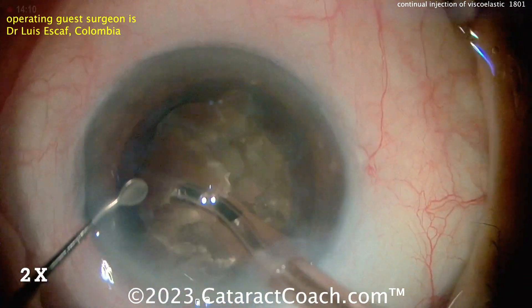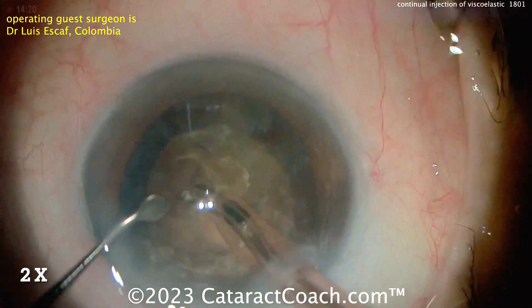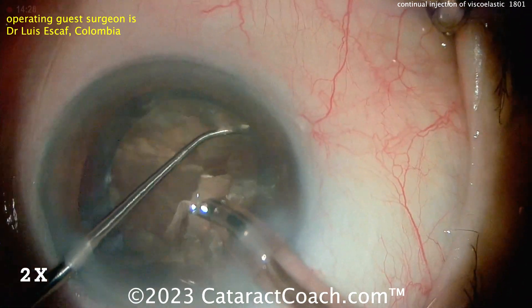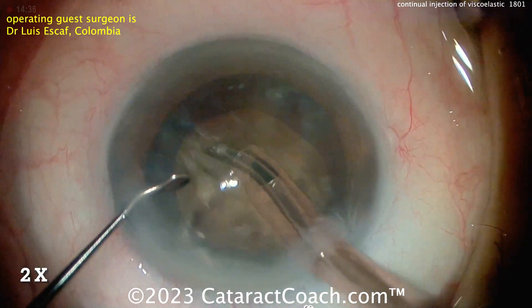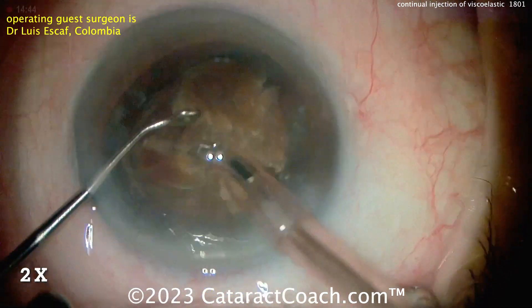Now, this brunescent cataract — you see it's still kind of attached. That's that fiber, thick, dense, leathery posterior plate of the nucleus. So sometimes it's hard to really split these pieces. It's why you've seen videos of tilting the nucleus out of the bag, getting the chopper on the back surface, the posterior aspect of the nucleus, just to really get under there and get it separated out.